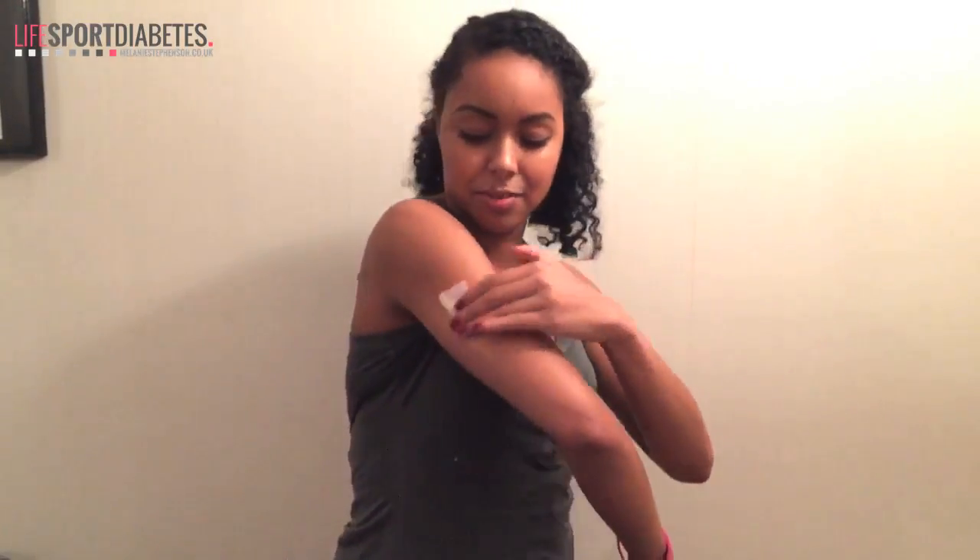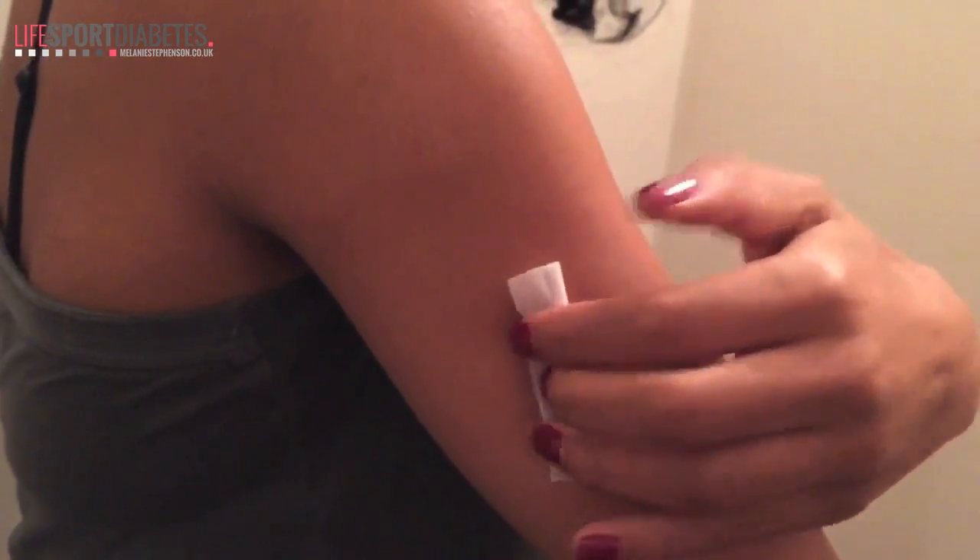I wore the sensor in my left arm last time, so I'm going to rotate it to my right. The sensor needs to be attached a little bit higher on the arm and a little bit further around, so it doesn't knock on anything, although the last one I wore was really well attached.